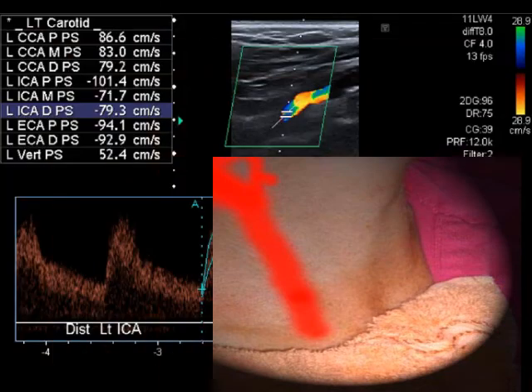The position of internal carotid artery is usually more lateral and posterior in the neck. Be mindful that in some cases, the internal carotid artery may be very short due to high bifurcation or very tortuous before entering the skull.